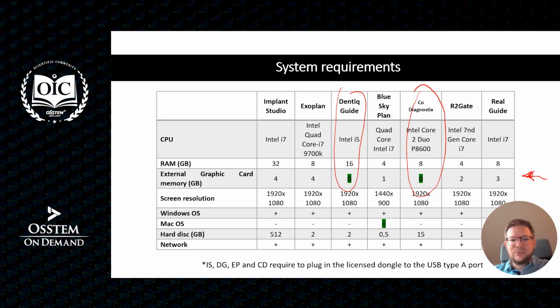Anyway, all of them require quite strong system specification, mostly at least an i7 Intel processor. Dentic mentions an i5 is available, but the suggestions are to have quite strong systems.